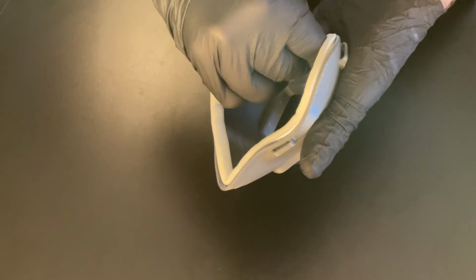Fold the seal strip in half, tuck and stick the fold, sticky side up, into the top of the mask, or the bridge of the mask. Press down on the silicone rubber around the inner edge of the mask until the entire mask is completely sealed.